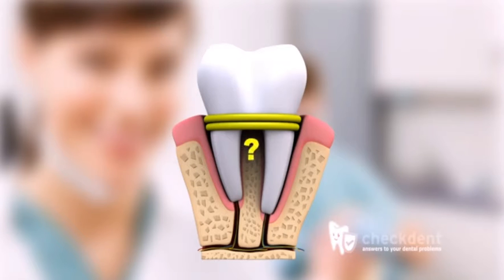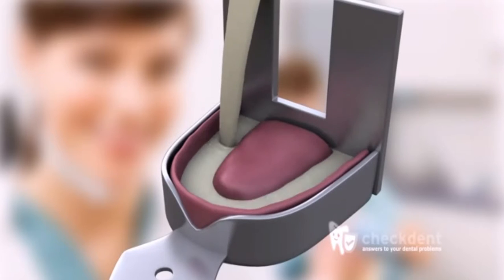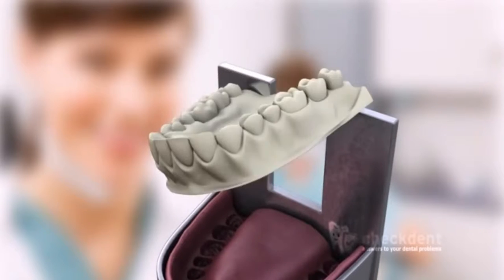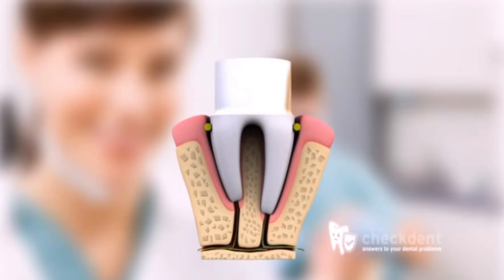Fair enough, but why 2 gingival retraction cords? Once the technician pours plaster into the impression, this creates a plaster model of the teeth. Because the margins of the prepared crown must fit tightly along all the edges, these edges should be clearly visible to the technician in the impression. Therefore, the impression material should flow right up to the preparation margins.